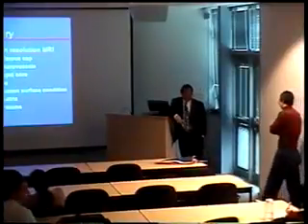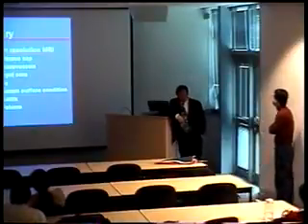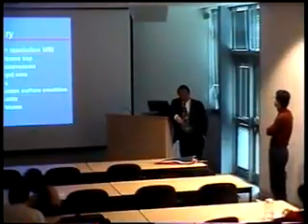When you do those T1 weighted images, do you gate them? We don't gate on T1. I think that if you look at a younger generation of patients, gating is more important. But for this type of patient, most of the patients we do are in their 60s and 70s, the arteries are hardened enough that they don't move much at all during the heart contraction.